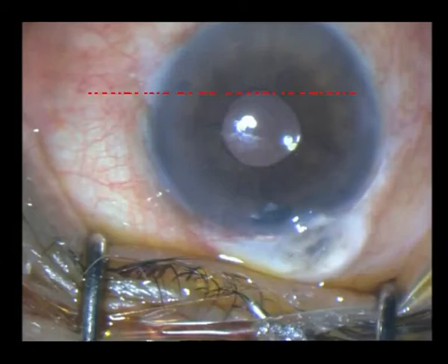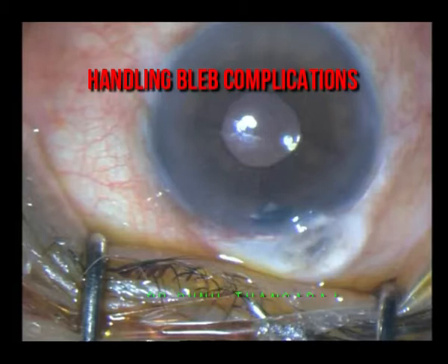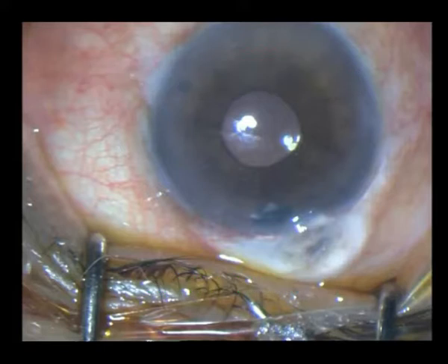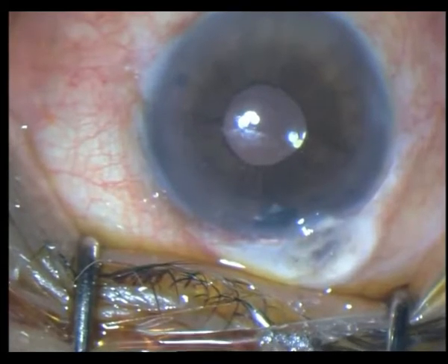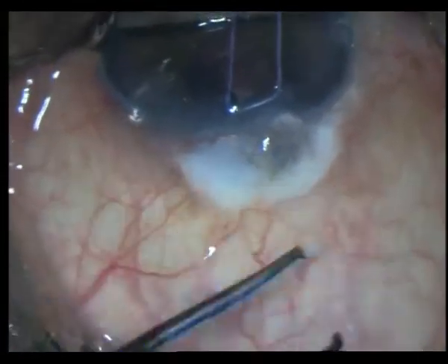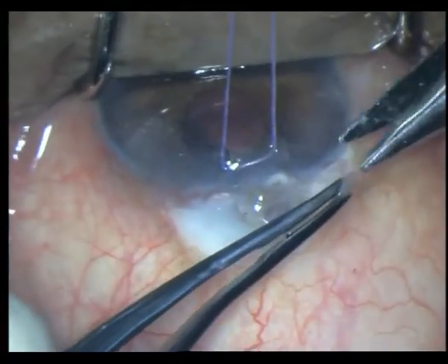This is an elderly gentleman who had undergone a trabeculectomy, a combined procedure many years ago, and he came back with a cystic bleb. The pressure was only hardly recordable — somewhere at zero — and on the Seidel's test we found that his bleb was actively leaking. Luckily he did not have any other complications of hypotony such as macular edema or choroidal detachment, and we decided to immediately repair this chronically leaking cystic bleb.